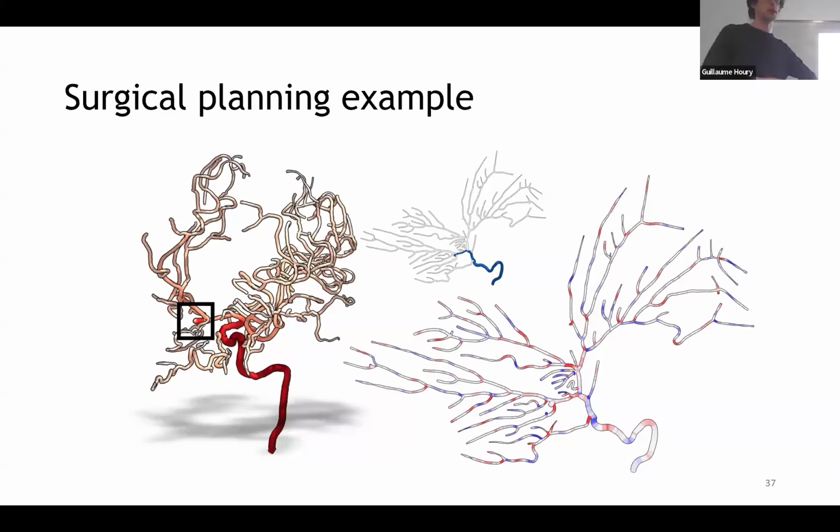That is an order of magnitude, and this is a smaller example, so it's a couple of seconds to compute. On the raw data we showed you, even the pre-processing is very fast. That was really a big constraint for us, because we work in a clinical environment. You want something that runs in a few seconds on a normal laptop. Otherwise, there's absolutely no chance it's ever going to be used in clinical practice.